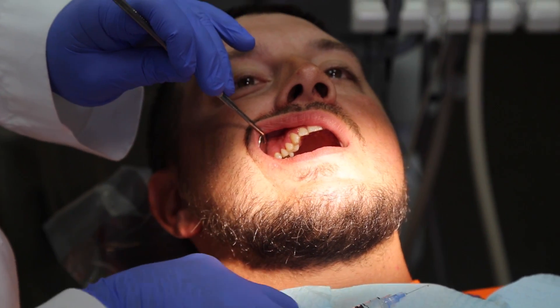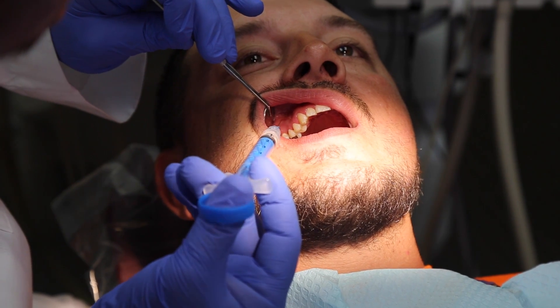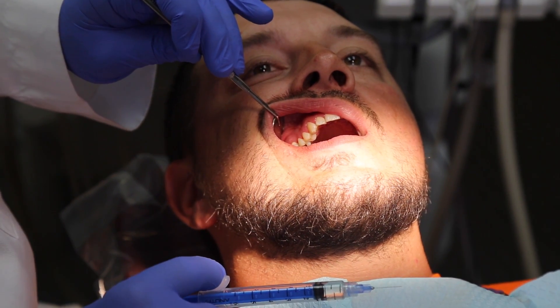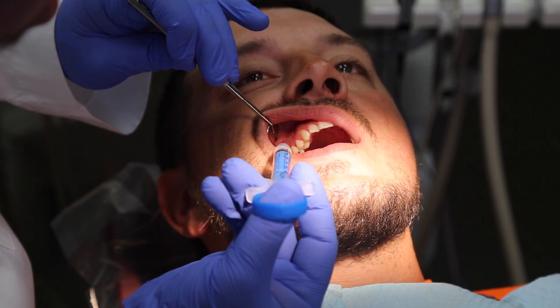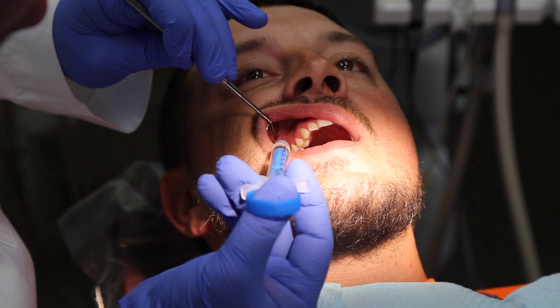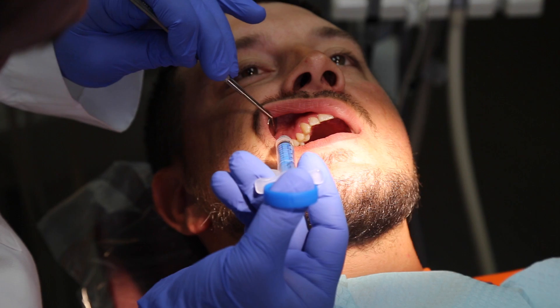I'm just going to put a little drop on the surface — this is the CO2 micro bubble. We're going to give it a chance to soak. The manufacturer recommends about seven to ten seconds to let that CO2 micro bubble literally soak through the gum tissue.